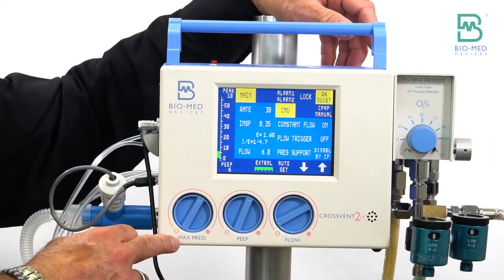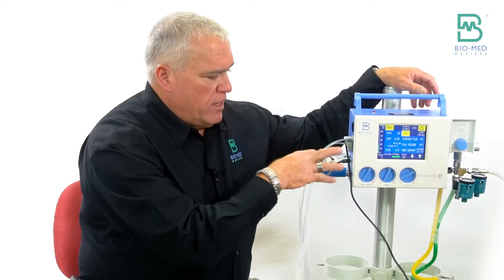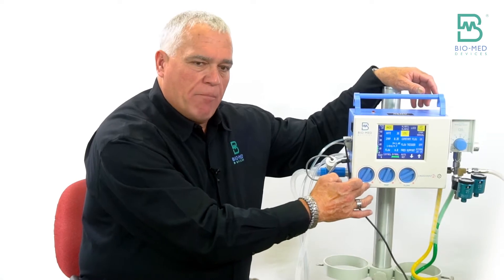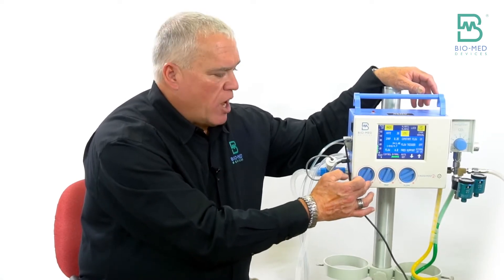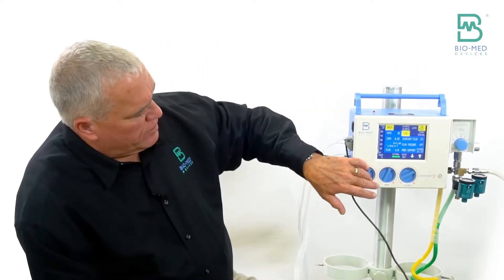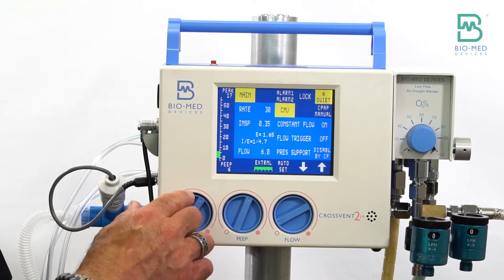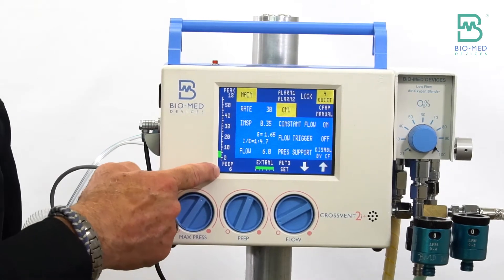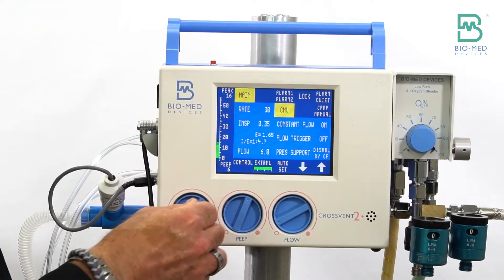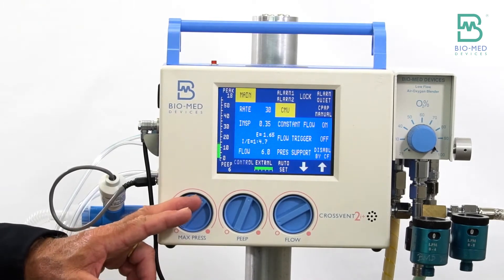The next knob — we call it the max pressure knob in the standalone version. In the built-in version, we actually relabeled that knob to the PIP, peak inspiratory pressure knob. They do the same thing. Basically, we dial this knob to set our peak pressure. As I turn this knob, this is the manometer. You can watch the peak pressure — it's easiest to look at the top number to see where the peak pressure goes and set it accordingly.